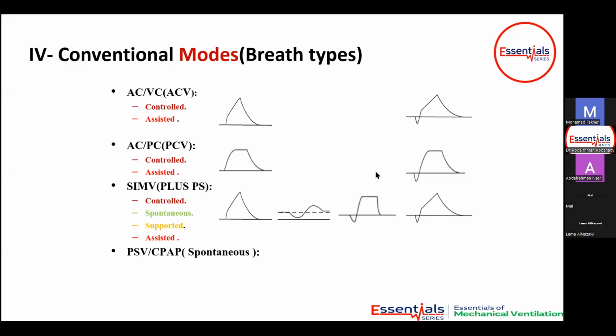What about the spontaneous mode? Spontaneous mode, CPAP or pressure support, CPAP plus pressure support, either gives spontaneous breath when you do not apply a pressure support, or gives you a supported breath when you apply a pressure support.